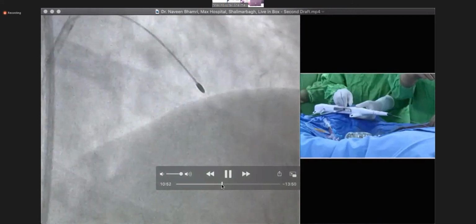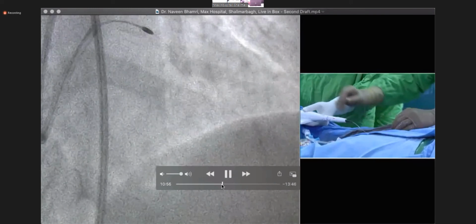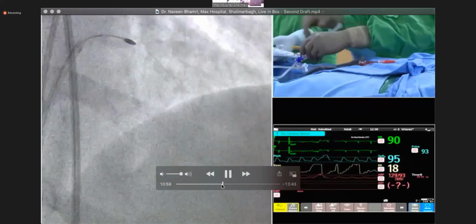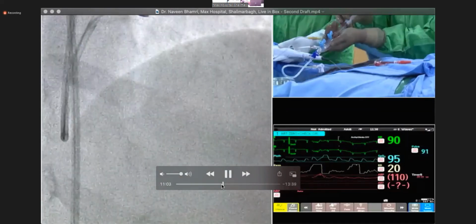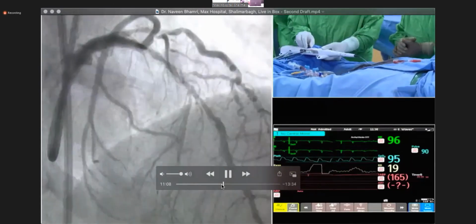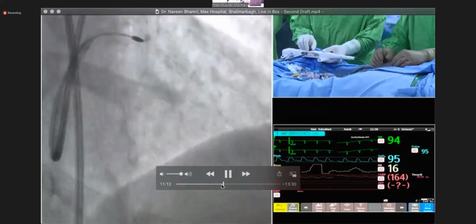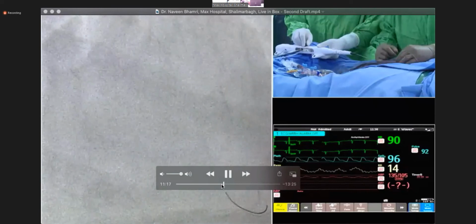So now we have crossed the lesion successfully without any interruption. We are checking to see for any slow flow or no flow phenomena. Everything is wide open, but you can still see the tightest point where there is a burr. So we are planning to give one more run of the rota at this point. Look at the speed.